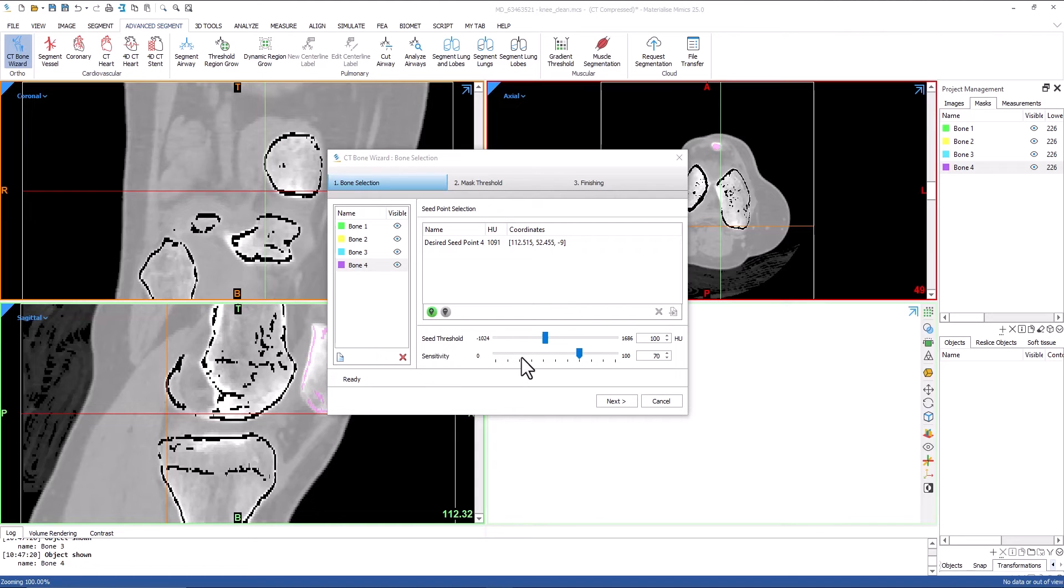Sensitivity defines the separation between the seed points. The sensitivity can help the separation of bones. The lower the value, the less the seed points will be detected, and the less chance there will be for leakage towards neighboring bones.